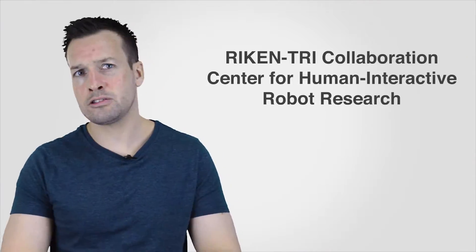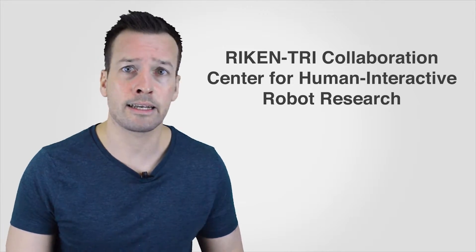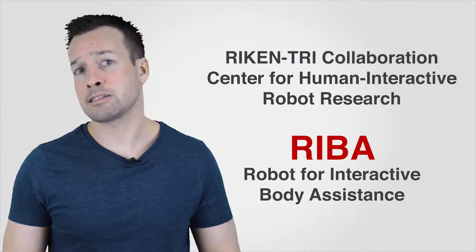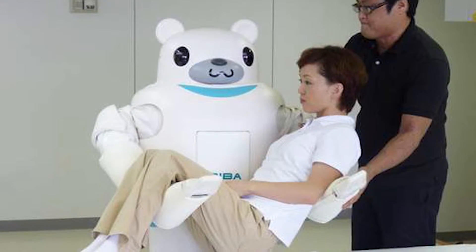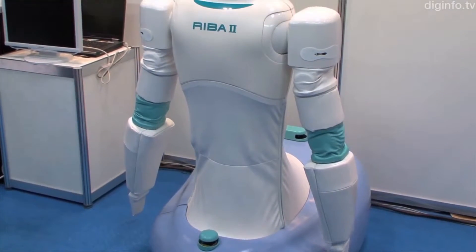In 2009, the RIKEN-TRI Collaboration Centre of Human-Interactive Robot Research, RTC — a joint project established in 2007 and located in Nagoya Science Park in central Japan — unveiled a robot called RIBA 1, standing for Robot for Interactive Body Assistance, designed to assist in lifting tasks. This was the first robot capable of lifting a patient from bed to a wheelchair and back. RIBA 1 charted a new course in caregiving robots, yet functional limitations prevented its direct commercialisation. RTC's new robot, RIBA 2, overcomes these limitations with added power and functionality.